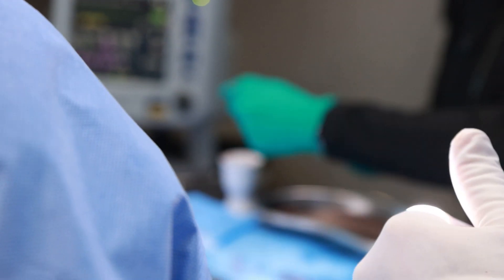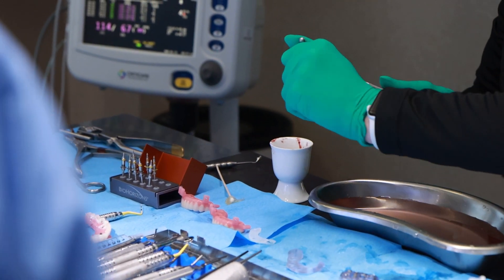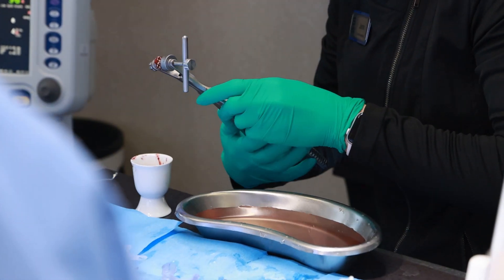I absolutely recommend this bone mill to anyone placing implants. It's a hundred percent worth the price. Even if you've never used a bone mill before and you're not used to autogenous grafting, you'll be able to grind bone into beautiful material with relative ease.